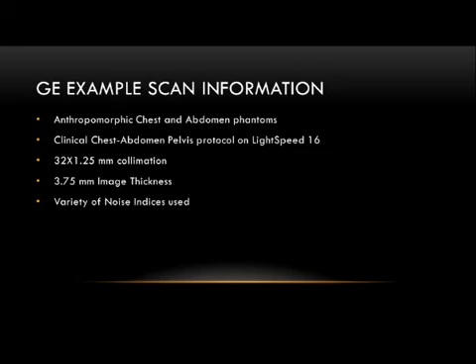Here's just for all of these, for a number of these systems, I scanned those phantoms and changed a number of the parameters, generally the image quality reference parameter, kept everything else the same just to see what the CTDIvol did and what the standard deviation of the noise is. And I'll go through these generally pretty quickly for each vendor because they're available on the slides, and there's not so much fun to be had by me just reading out numbers, which you can see.